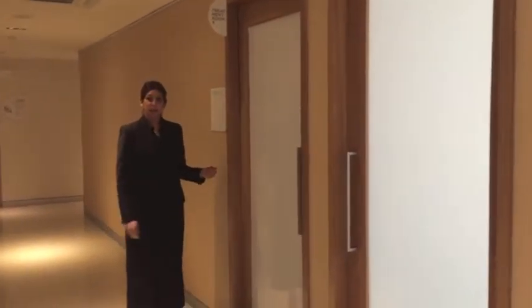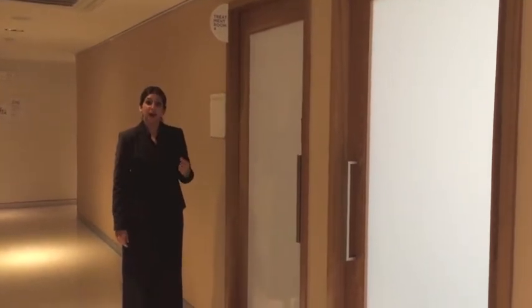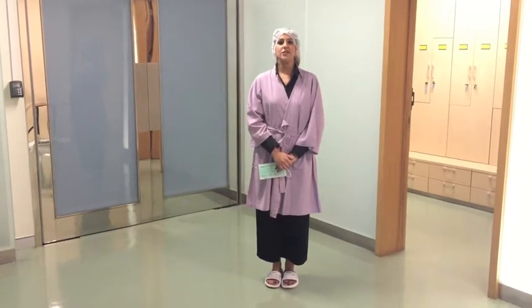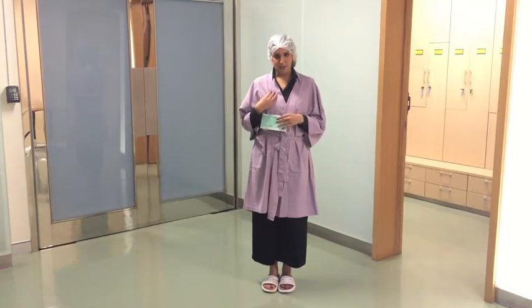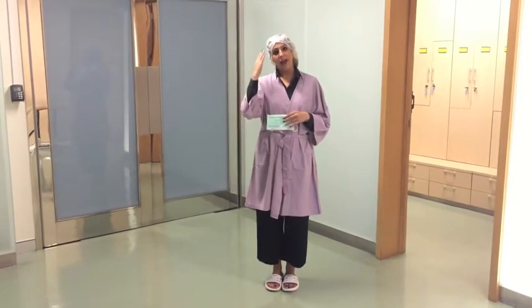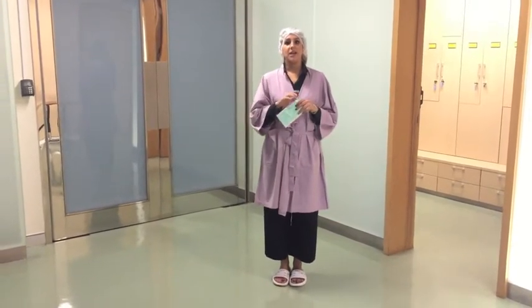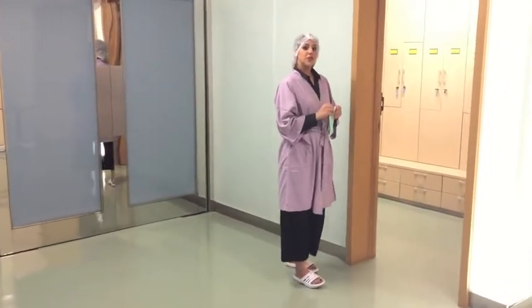Welcome to the genetic lab. The details of the lab will be followed after the explanation of the IVF lab on the 3rd floor. Welcome to the 3rd floor of the Bangkok IVF Center. As you can see, this floor is a completely sterilized floor. Once the patient walks in, they change their uniform, as you can see, to a sterilized uniform, a hat, their shoes, and a mask. This floor consists of 4 parts: the IVF lab, the surgical room, the IUI room, and the sperm collection room. I'm just going to take you through to the surgical room now.